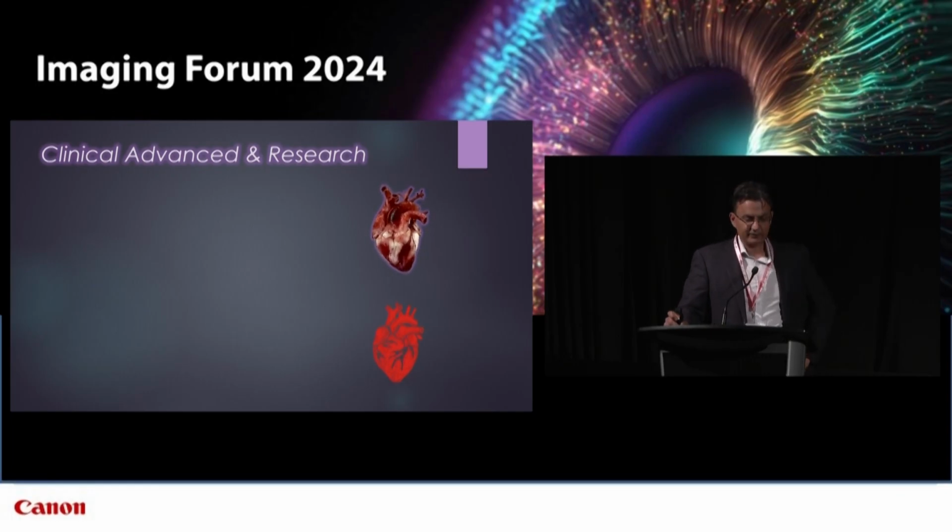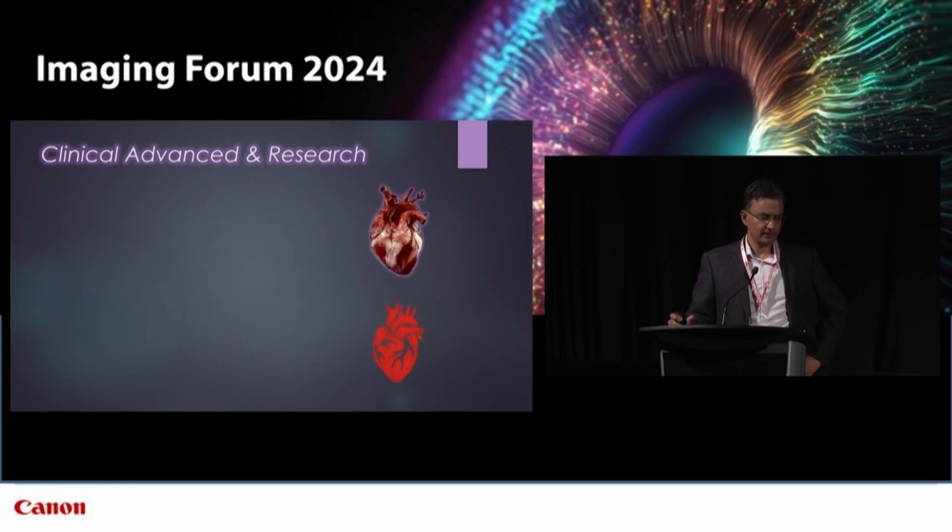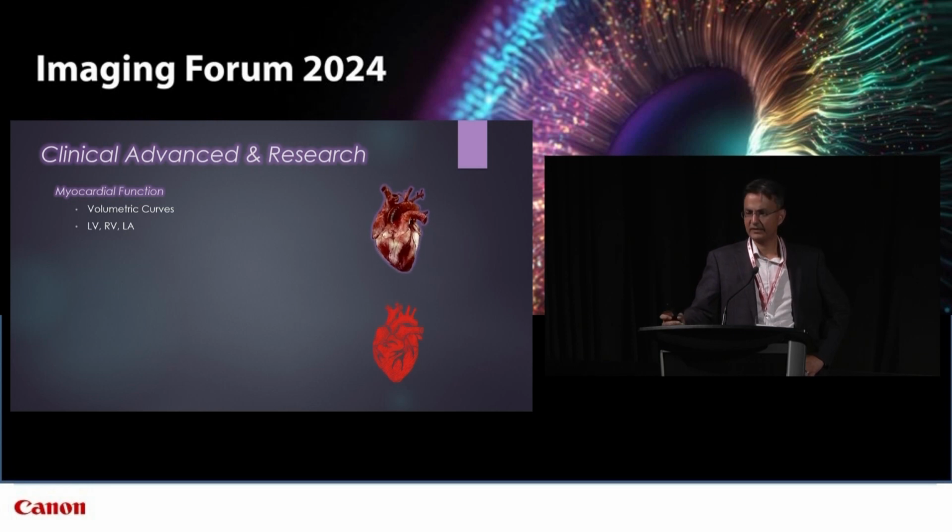So pivoting away from our routine to the more advanced clinical scenarios, as well as some research. We don't typically use CT for myocardial function. It's really not a standard of care. Echocardiography is ubiquitous. It's pretty reasonable at doing it. If there's any adjudication, we go to MR.